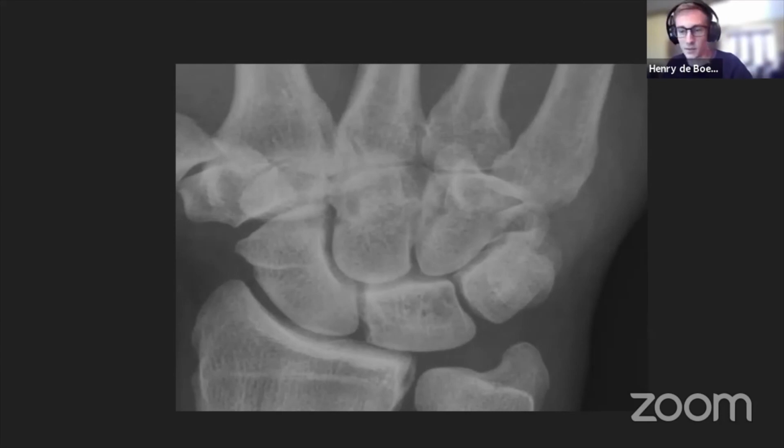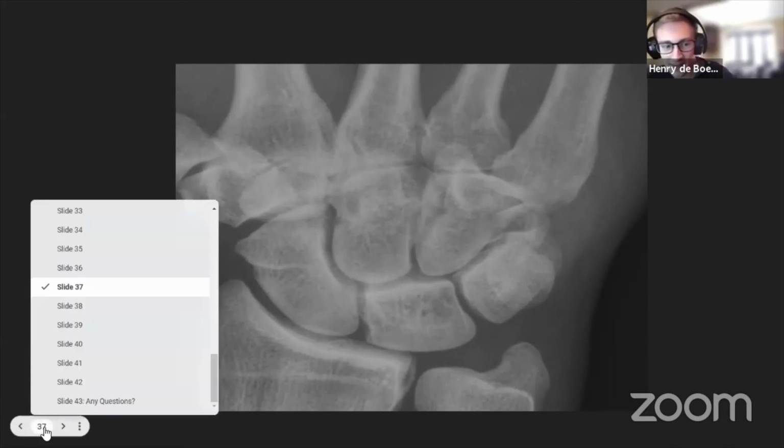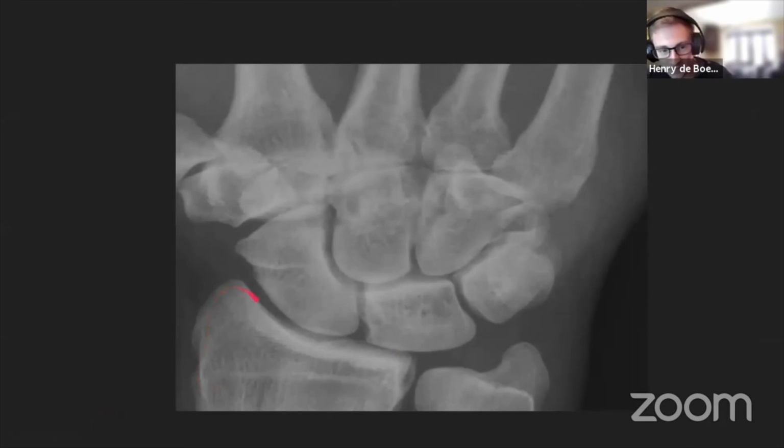Okay, so far limited answers. I'm going to take this to be that we're not sure. So we're starting to get towards the back end now. We've got 5 cases left. They're going to get tricky. So if you're not spotting these, I would not worry too much. Okay.